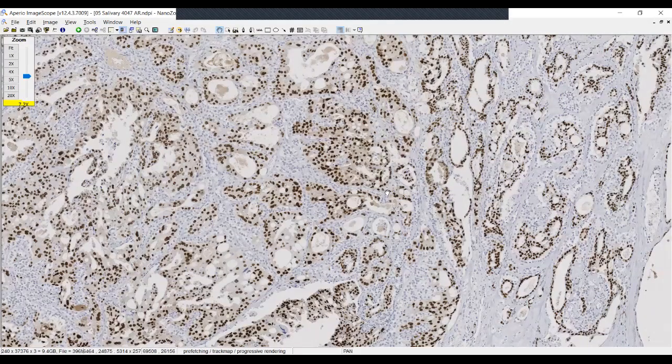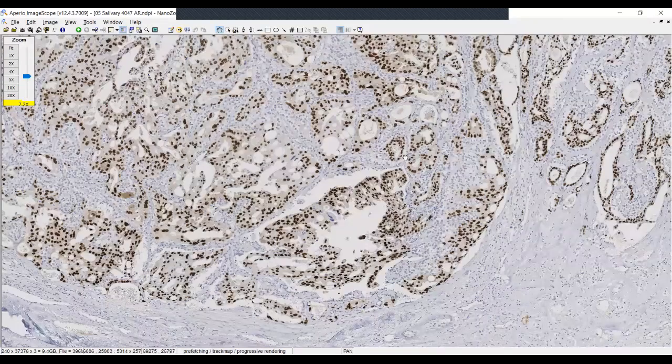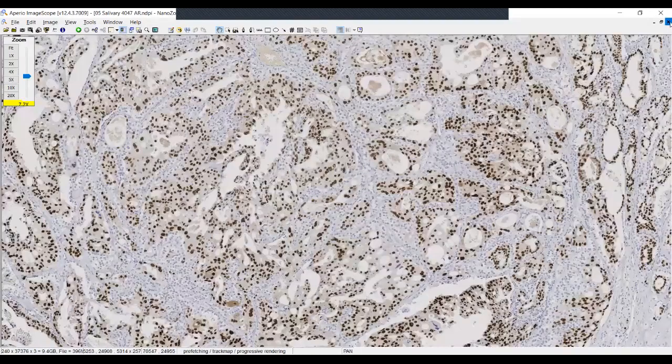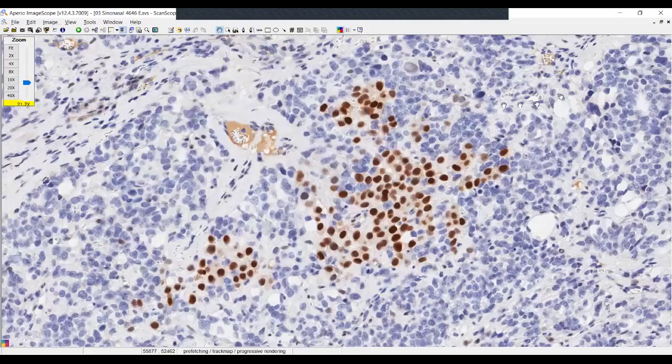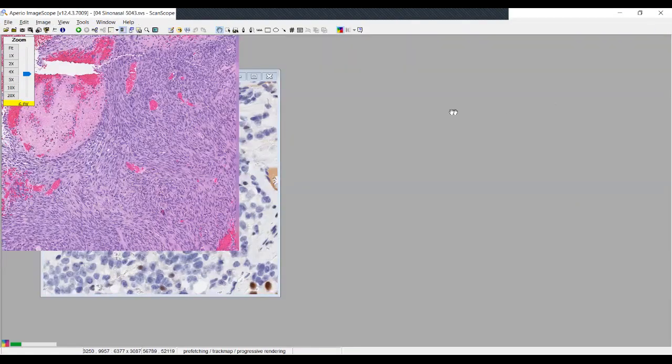But when you have this degree of cytologic pleomorphism that is just so incredibly profound, as well as invasive destructive growth with either perineural or lymphovascular invasion, that is what helps you make that particular decision in order to see what is going on.